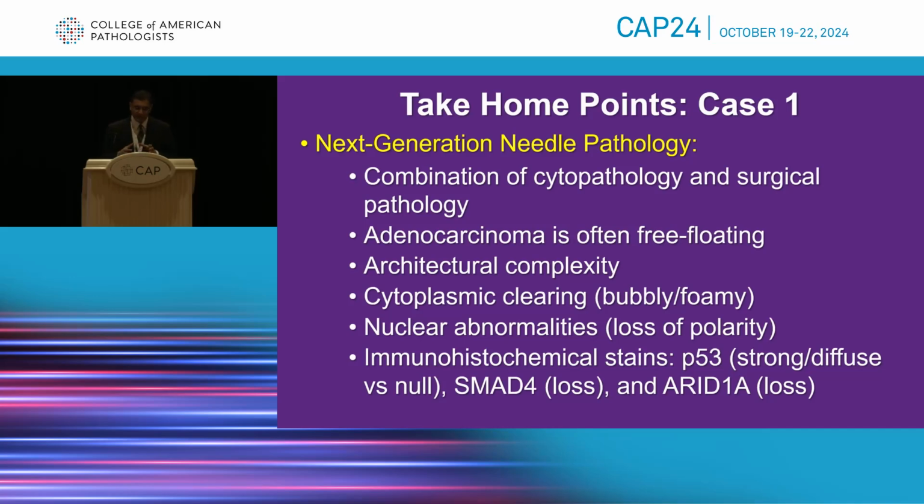And finally, because the needles have increased tissue yields, ancillary immunohistochemistry and molecular testing are now possible and quite helpful. I find the P53, SMAD4, and more recently ARID1A stains to be helpful for our group in trying to establish a diagnosis.